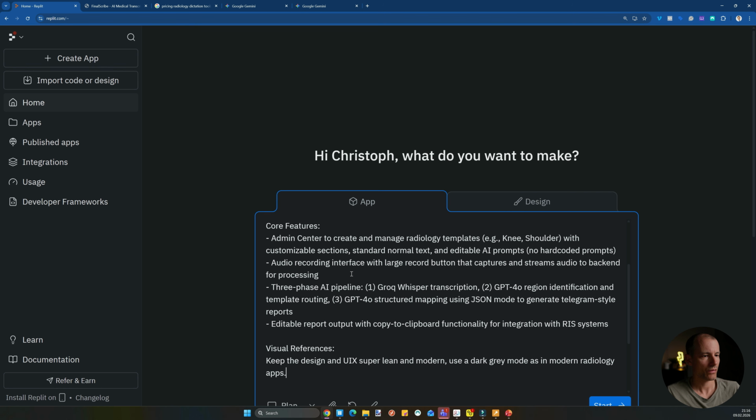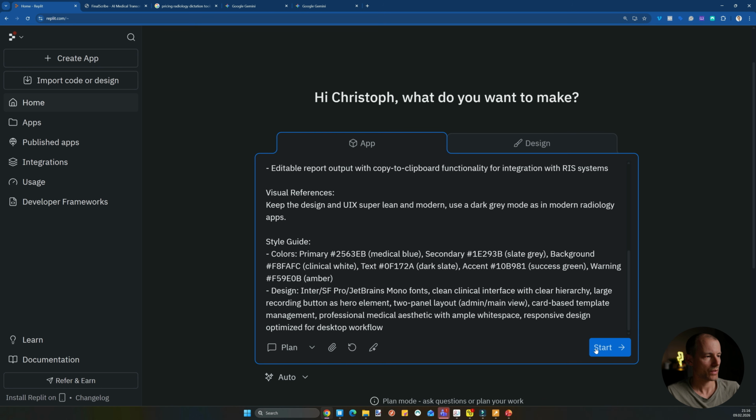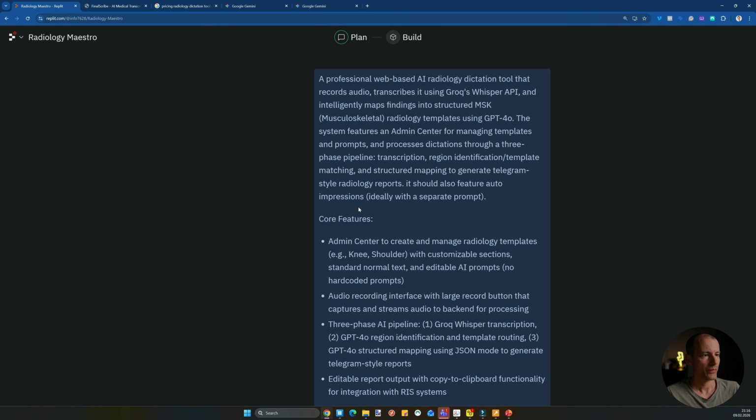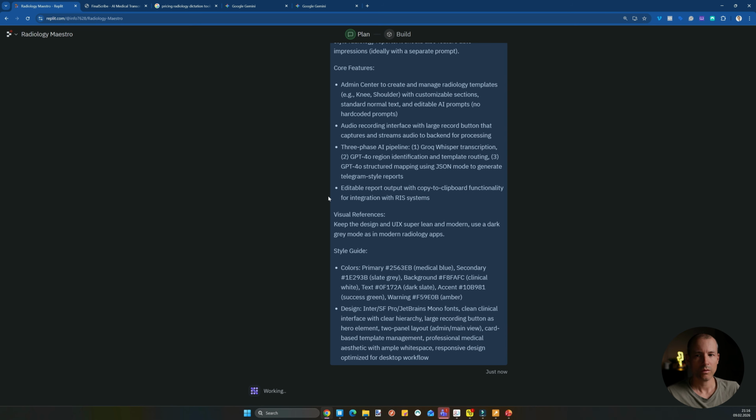But I think this is enough for us to get started. So let's see what it does. And I will pause the video because this will take a little bit of time. It will now assess this prompt. It plans out everything that we need to know.